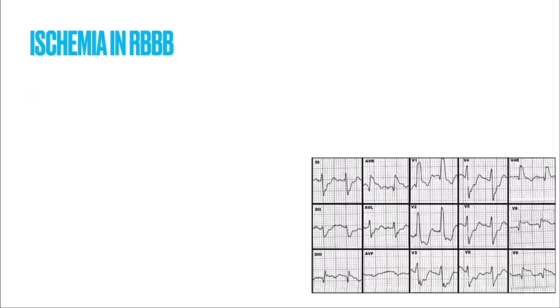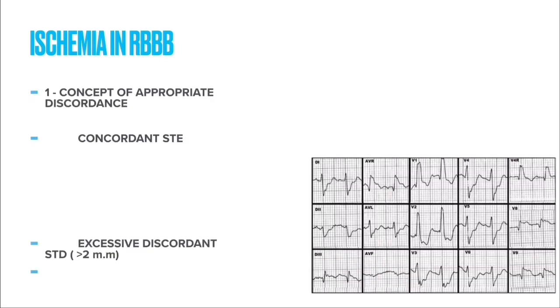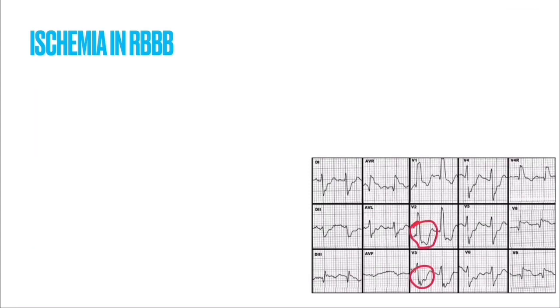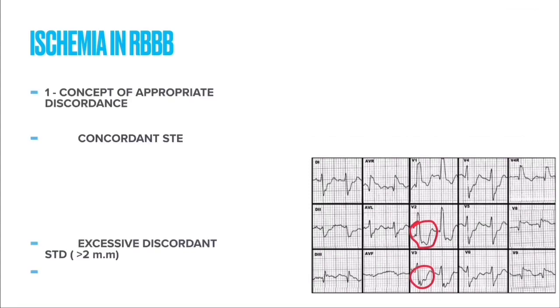The second finding indicating ischemia is excessive discordant ST depression of more than 2 mm. In this ECG we can see excessive ST depression in V2 and V3 — this level of ST depression we will not get in normal right bundle branch block, so it again indicates ischemia.